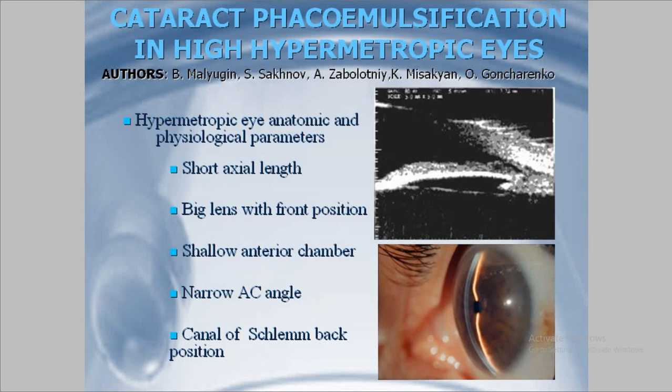In the given work, the authors presented the developed and put into practice approaches and technique variants of the phacoemulsification procedure depending on hypermetropic eye anatomic and physiological parameters and clinical character of cataract development.